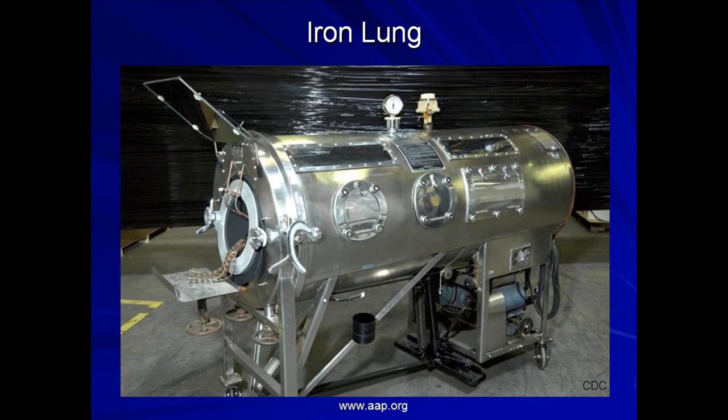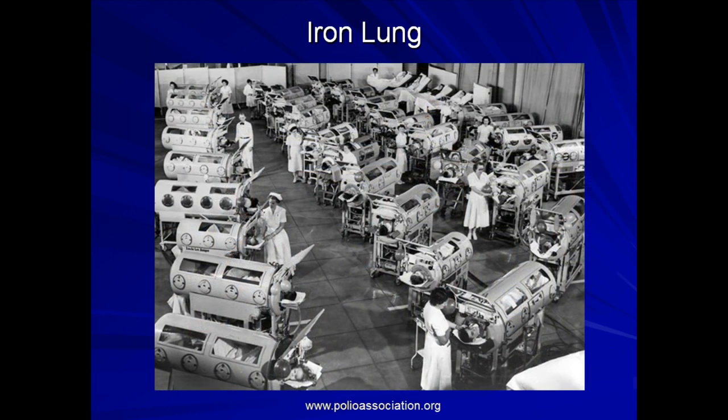The removable panels on the sides allow doctors and nurses to perform rudimentary examinations and provide hygiene without having to remove the patient from the chamber. Now, during the polio outbreaks of the 1940s and 50s, entire wards of hospitals were filled with children in iron lungs, as polio commonly affects the diaphragm and can reduce a patient's ability to take in breaths. Although images such as this may seem depressing today, without the iron lung, probably every single patient in this ward would have died.